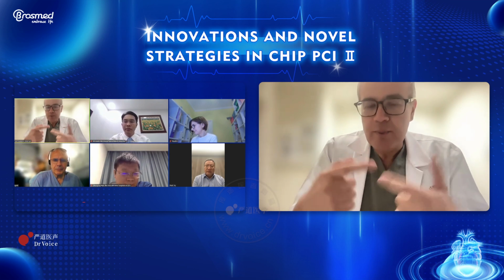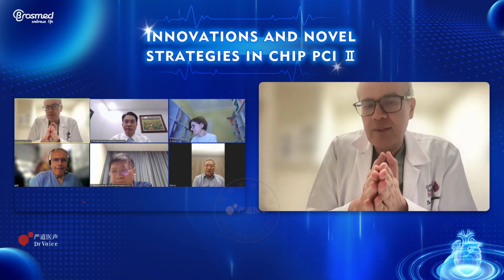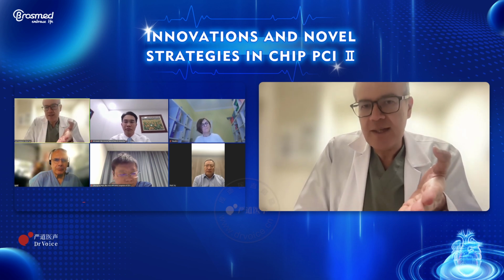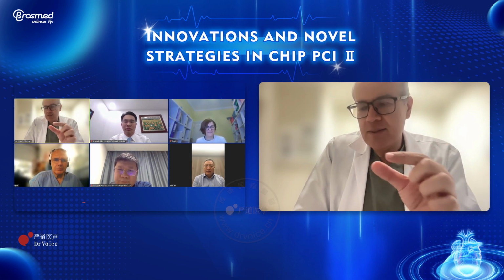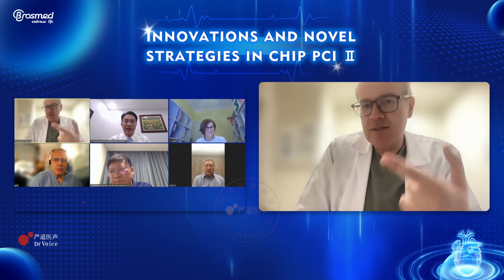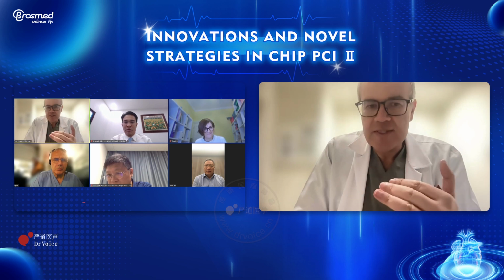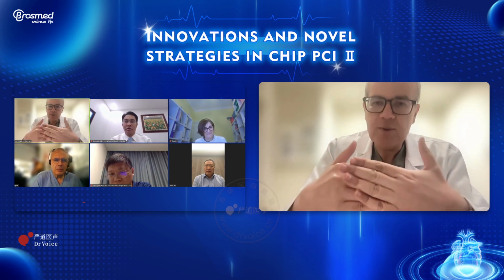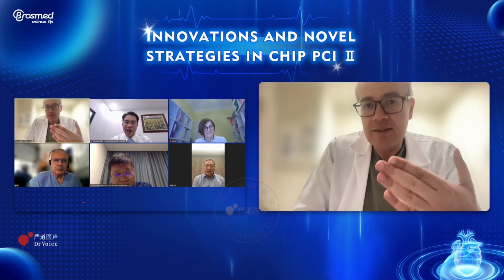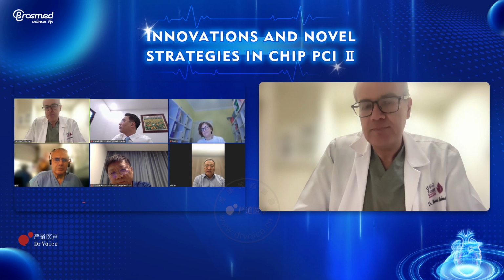But if it grows too much because of the injury induced by the balloon, the vessel will get narrowed again. So the aim of the drug-coated balloon is to treat this atheroma with an anti-proliferative drug so that the neo-intima develops, but not too much. We maintain the thrombus-resistant surface without growing too much and encroaching on the lumen. That's why I believe we still need the drug for the long term in patients with ST elevation myocardial infarction.